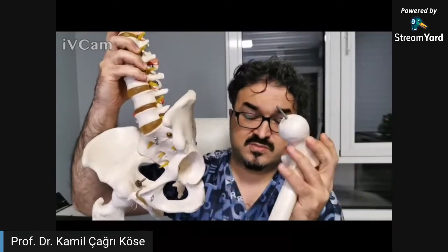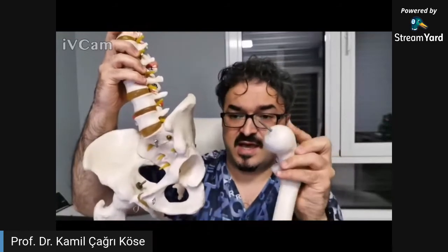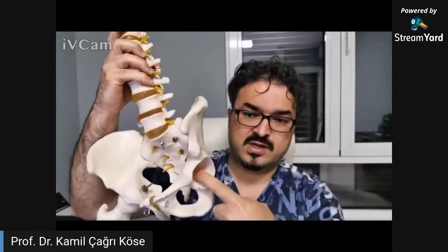But in total hip prosthesis, we change the head and also change the socket.